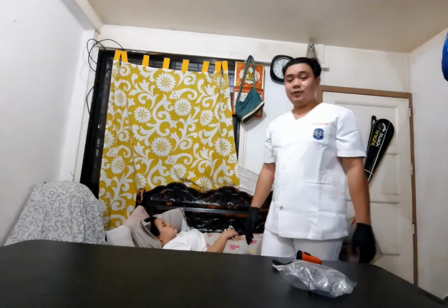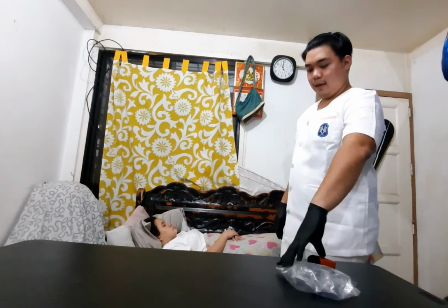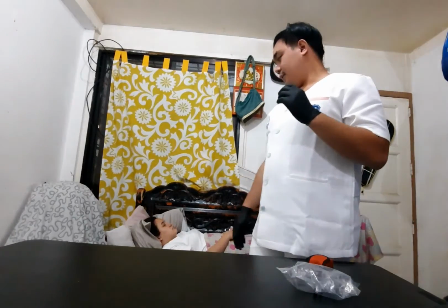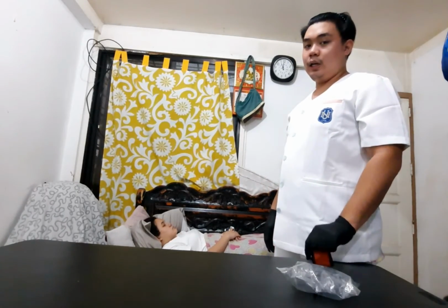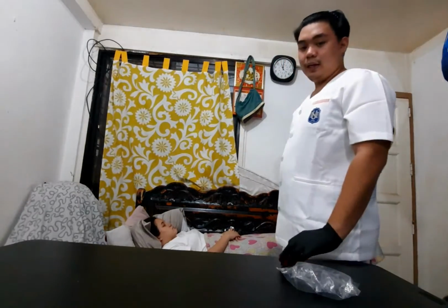To monitor the oxygen saturation level of the patient, which is the oxygen in the body of the patient. And then assess the patient regularly for clinical signs of hypoxia, tachycardia, confusion, dyspnea, restlessness, and cyanosis. And also monitor the patient's oxygen saturation, including his or her ABG, 20 minutes after initiating the therapy as ordered by the physician.